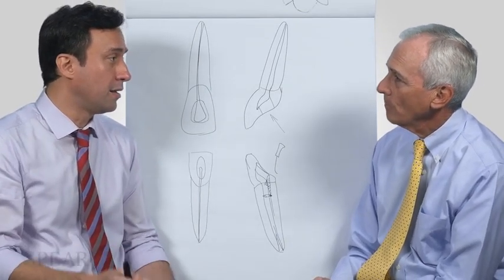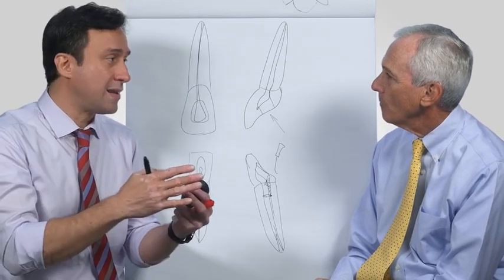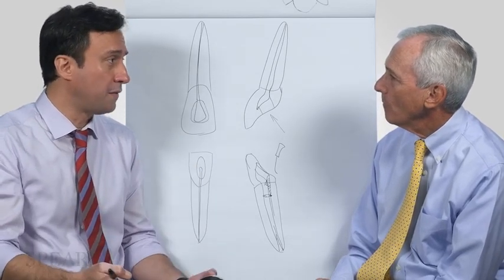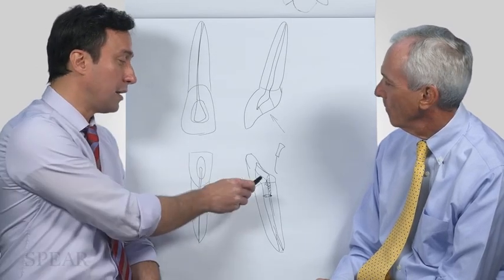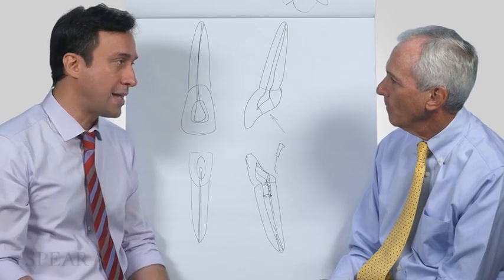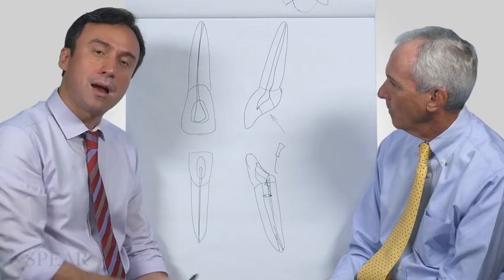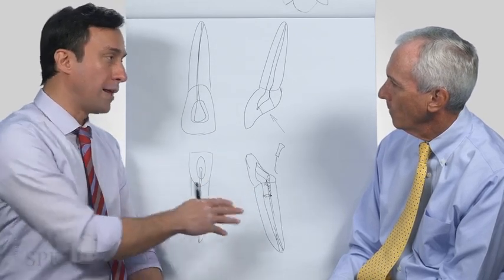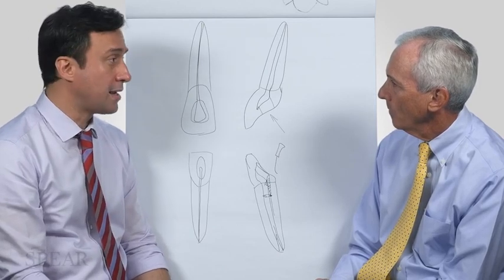That's the thing. I don't ever break them, but you need to replace them often, because as the diamond gets denuded, then it loses its efficacy in terms of cutting, and then it really is no use. So in a situation like this, you'd have to use a new E14D, or one that hasn't been used that often, so the diamond particles are still nice and fresh, and then you scrape up and down in that area, being careful and cognizant of where the outline of the root is, and that's how you would end up finding it.